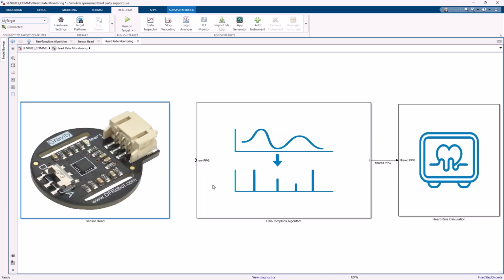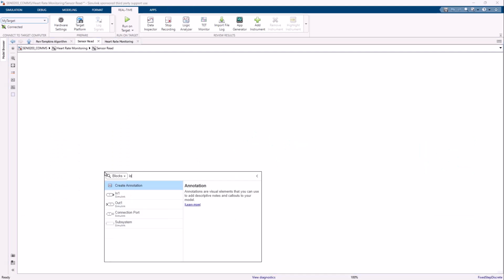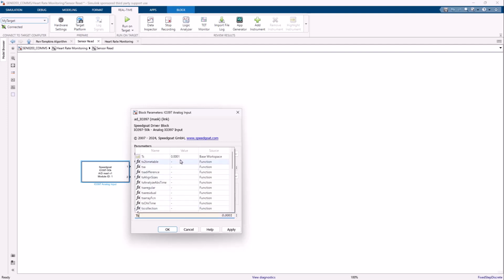In order to read in the PPG signals from the sensor, we only need to add a few blocks. First, we will add the Speedgoat IO397 analog block, and going forward with the other blocks, we will be adjusting the parameters based on the baud rate and the sampling frequency. I will not go into the details here, but the main point is just how readily available the blocks are and how straightforward it is to adjust parameters.